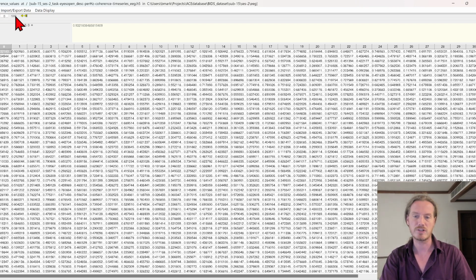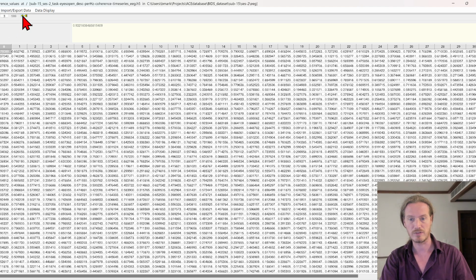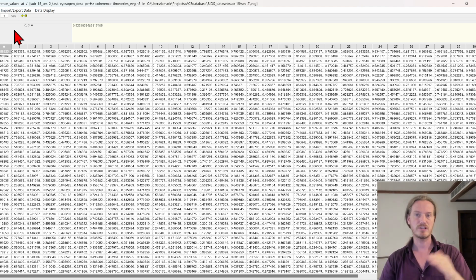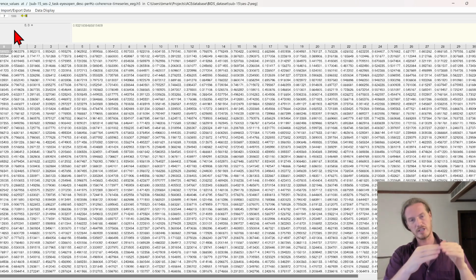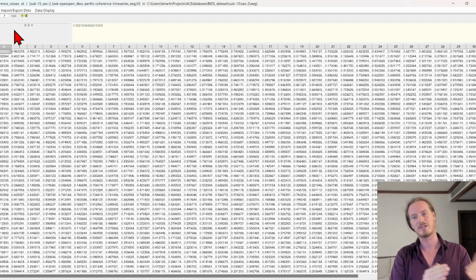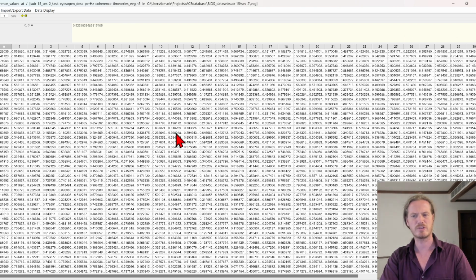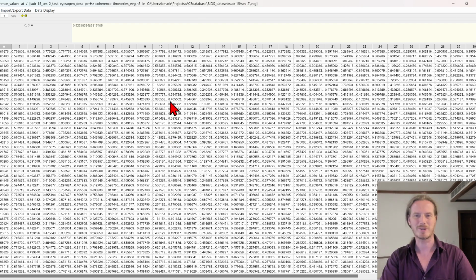But it goes further. You can see this counter over here. It goes from 0 to 599, so in total 600 pages. And as I flick through this, you can see every time it changes. For every second of data, we have saved the coherence for every coherence pair on every frequency. So this is a tremendous amount of data. And of course, we're not going to stare at these numbers in this chart.